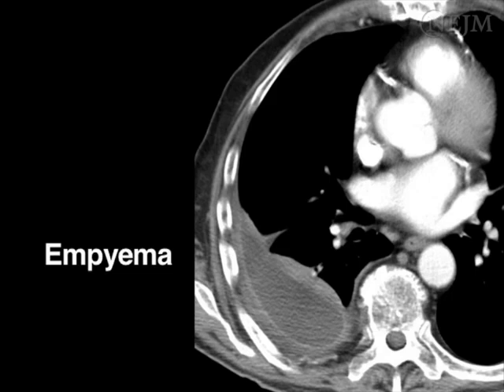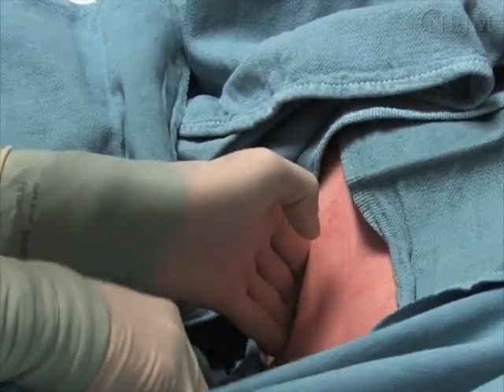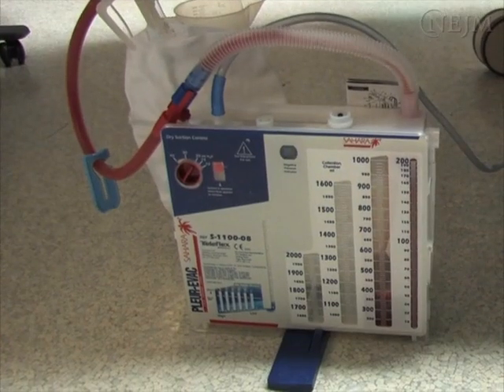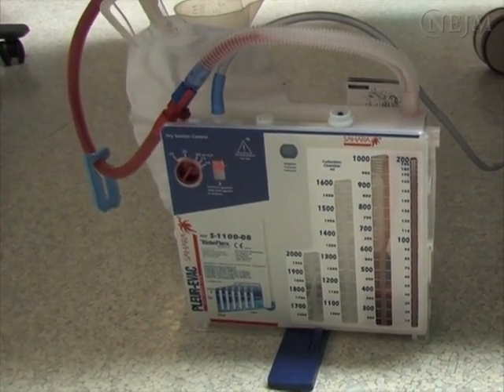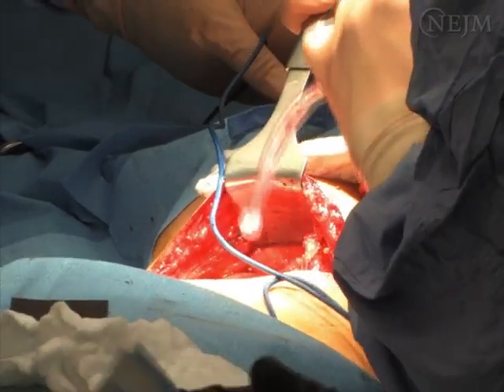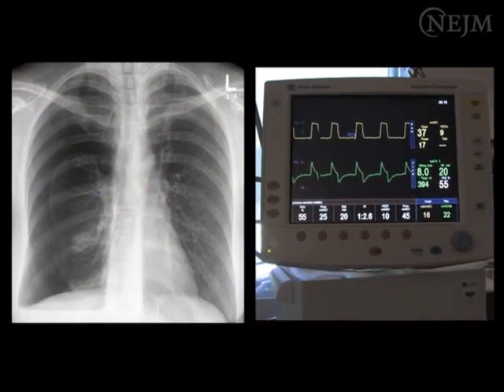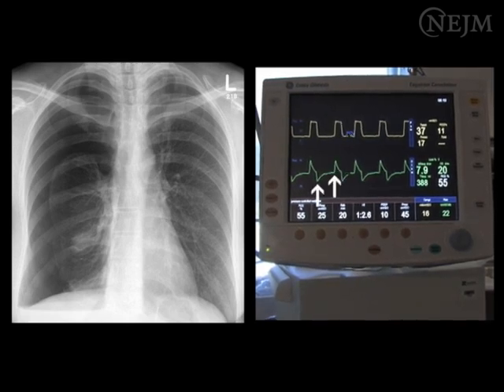If a chest tube was placed for empyema, removal of the tube should be considered only after the patient has stabilized clinically and the drainage criteria are met. If an air leak is persistent or the pleural fluid drainage criteria are not met, a pulmonary specialist or thoracic surgeon should be consulted for more definitive, potentially surgical management. Pneumothorax risk is no different after chest tube removal during end inspiration versus end expiration.